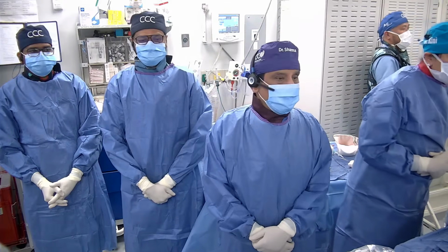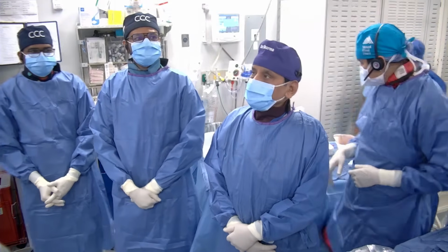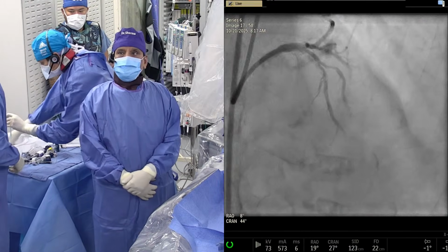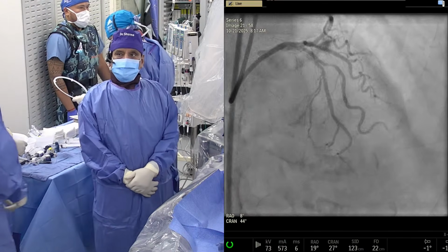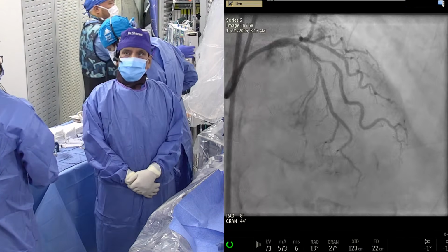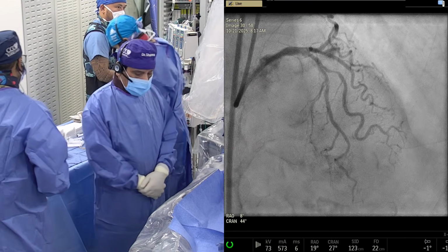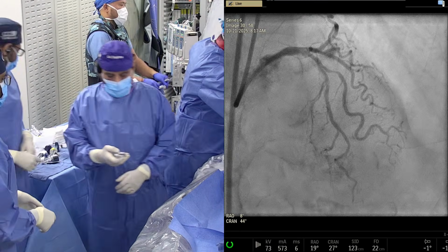Actually, if we can just show the angiogram right away, because I asked Anu what we are showing differently this time. He said, well, this is a case with both vessels very calcified, and a long lesion. The lesion starts way before, with the calcium. Maybe something different in terms of the teaching will be shown in this particular case. With that note, I think we start, knowing that we are a little late here.